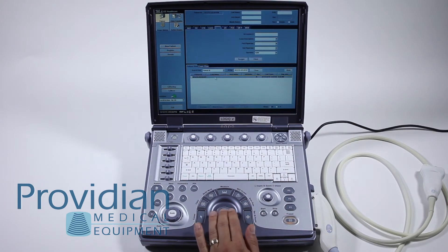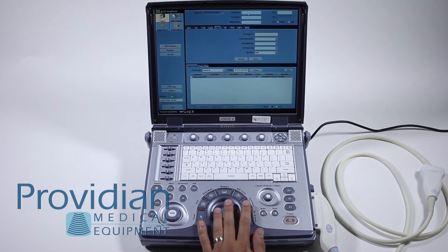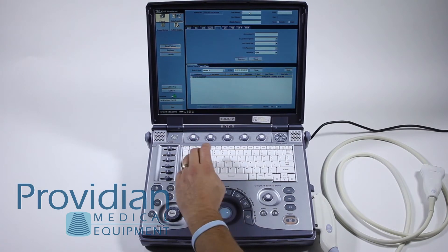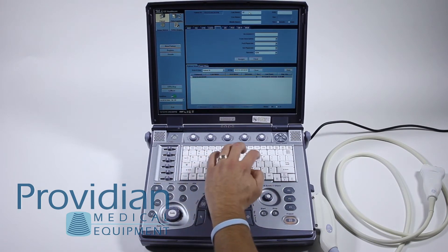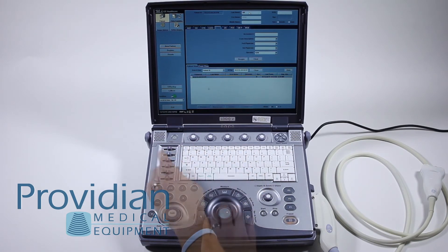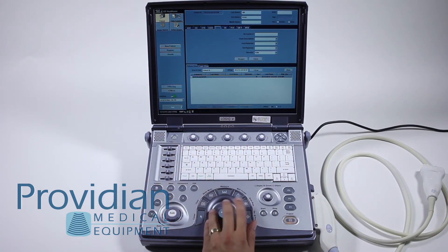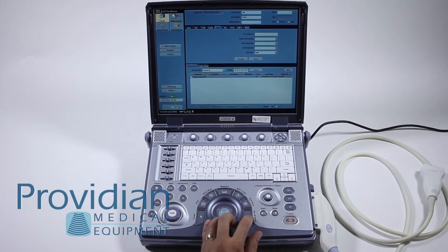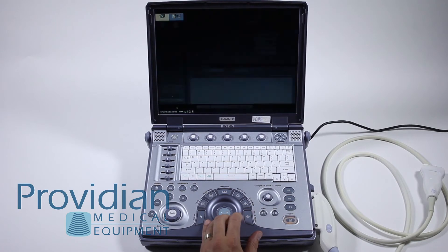Now we have this patient ID. There's no name assigned to it, so we're going to go ahead and enter a new patient. I'm going to click exit.